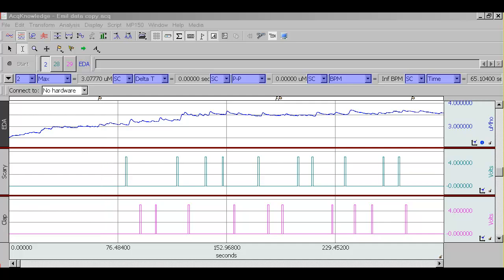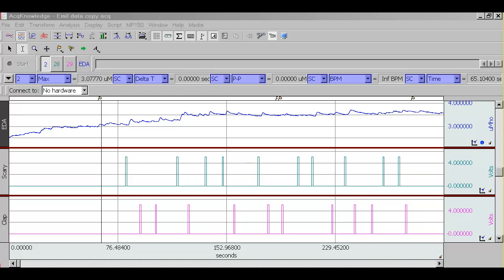Starting with version 4 of ACKNOWLEDGE, you can perform event-related analysis on skin conductance data. The following screencast is a quick overview of the capabilities of the software.